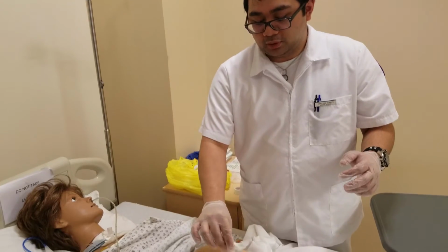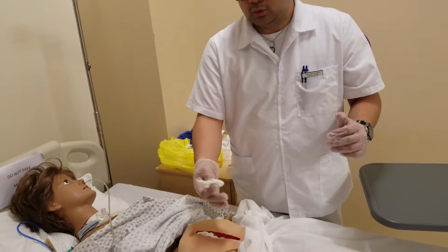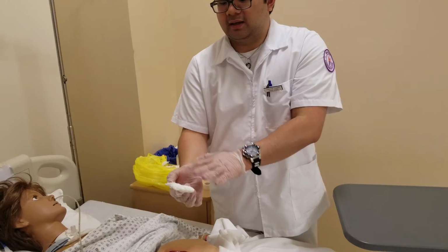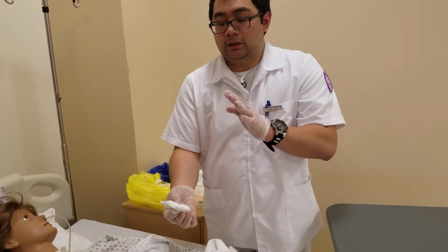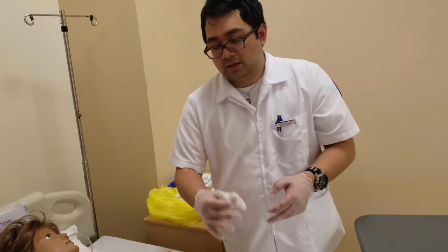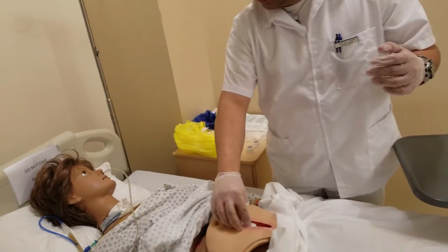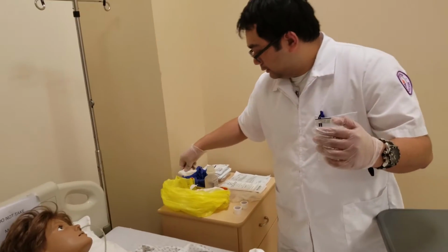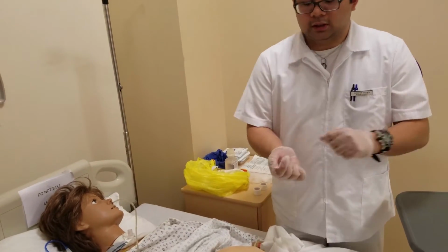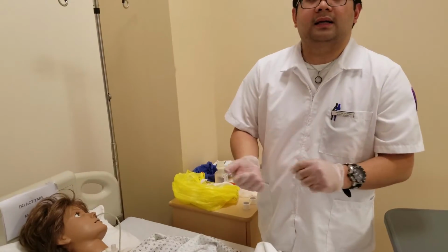Also, once you get to the part where you're removing the packed gauze from the wound, you want to make sure that you're noting what this specific gauze looks like. If it's soaking up a lot of blood, or it's mainly pus, or is it just serum. Take note of that, because you are going to have to document it, just like so. Once again, we're just taking a look at our wound here. Looks good for now. Nothing too out of the ordinary.